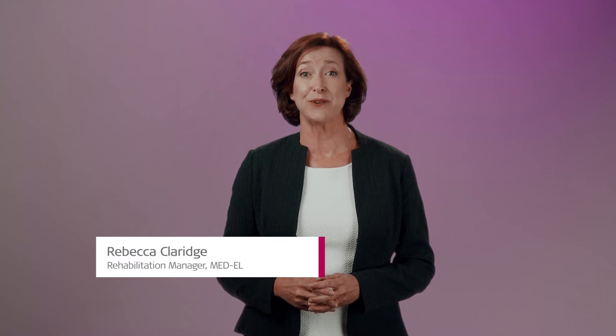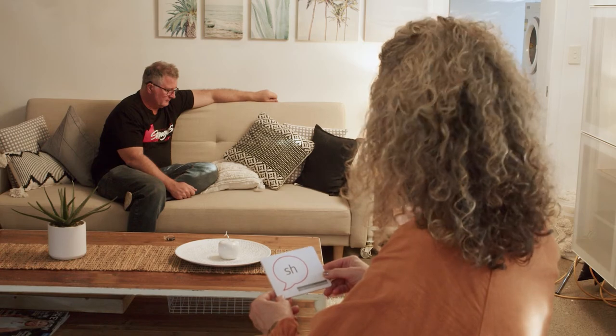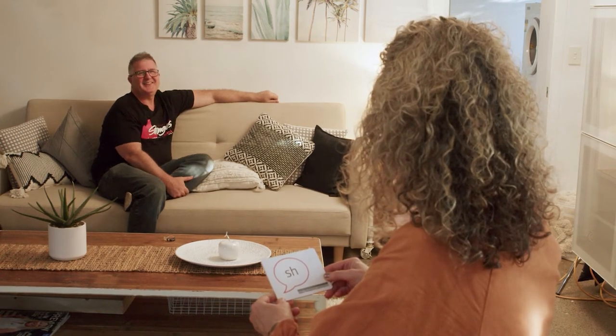Hello and welcome to Rehab at Home with MED-EL. In this series you'll meet four people who made decisions to get cochlear implants as adults. To begin, we will see John and his wife Donna do the Ling Sound Check. You can do this quick test at home to check your hearing technology is working well and you're able to hear the full range of speech sounds.